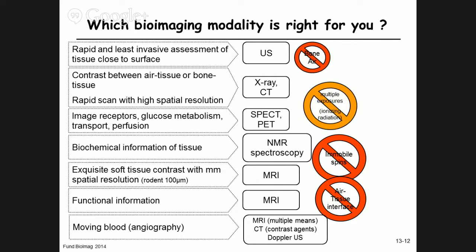The thing to bear in mind is the limitation for X-ray techniques is the number of scans that one can do. Okay. Computed tomography, SPECT or PET, is not the modality you want to go in as a volunteer every other week, no matter how much they pay you. Okay? On the other hand, with MRI, you can do that.